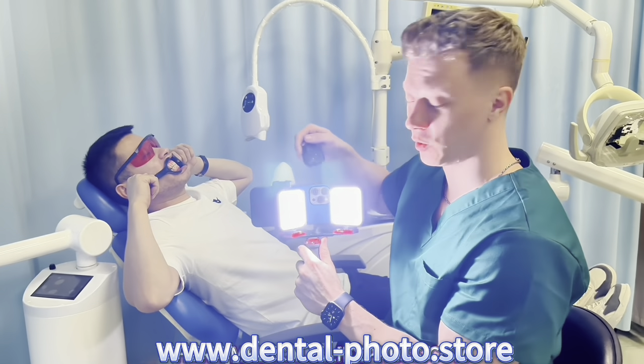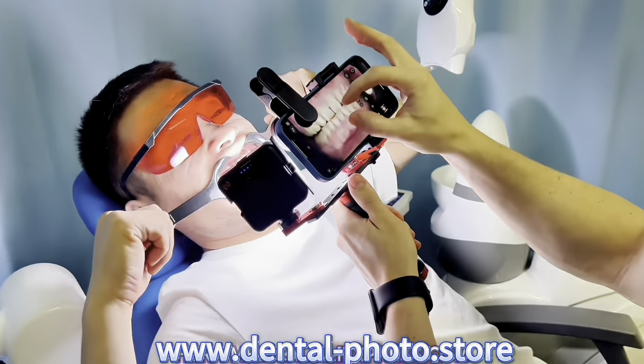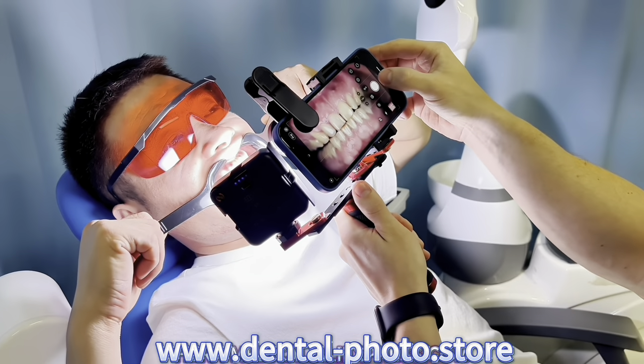Now let's try the 100 millimeter macro lens. First let's take a photo of the front teeth. And now the molars.